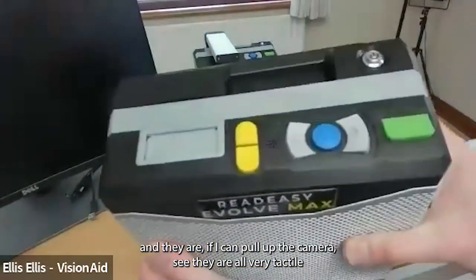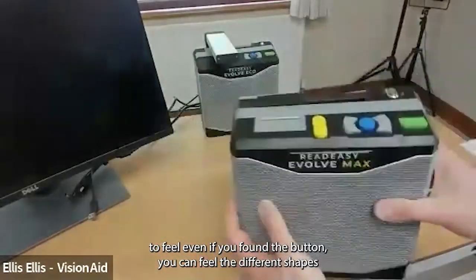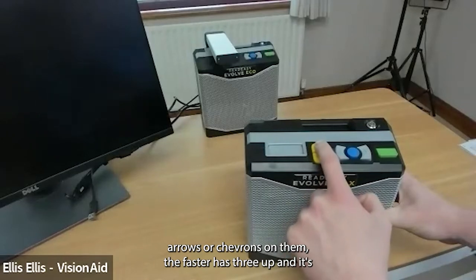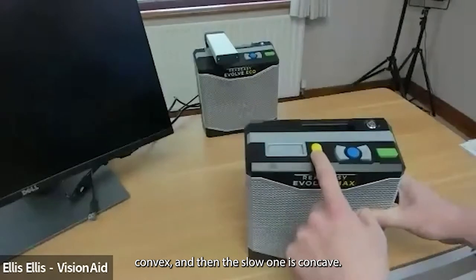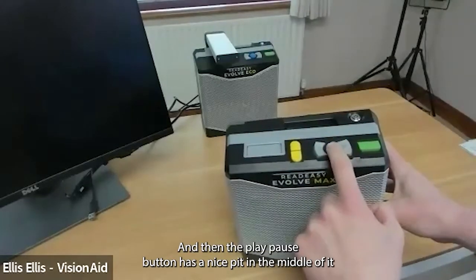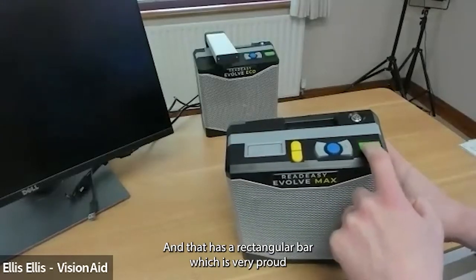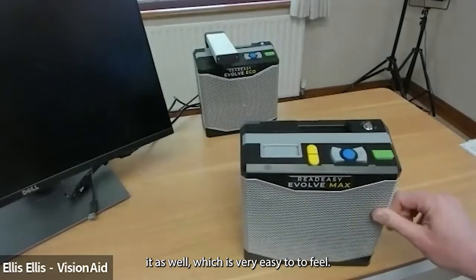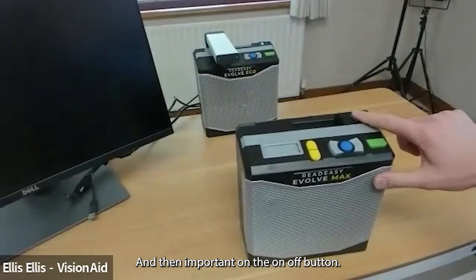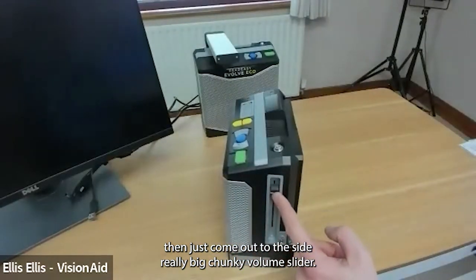The main unit has six tactile buttons along the top edge. They are all very tactile and even the markings on the buttons are tactile as well, so it's really easy to feel. The faster and slower buttons have up and down arrows — the faster button is convex with three up-chevrons, the slower one is concave with a single down arrow. The left and right buttons for forwards and backwards by sentence have left and right arrows, the play/pause button has a pip in the center, and the capture button on the far right has a rectangular bar which is very proud.